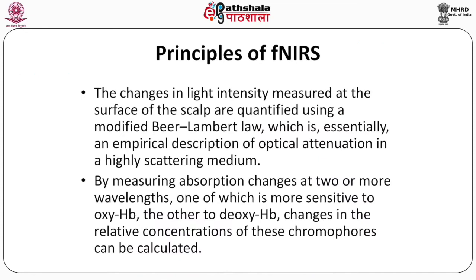We are continuing with the principles of functional near-infrared spectroscopy. The changes in light intensity measured at the surface of the scalp are quantified using a modified Beer-Lambert law. It is a hemodynamic law, which is essentially an empirical description of optical attenuation in a highly scattering medium.